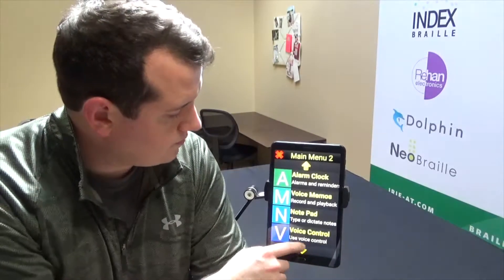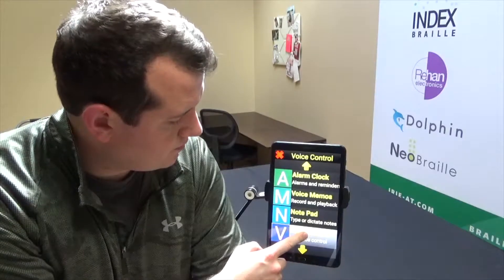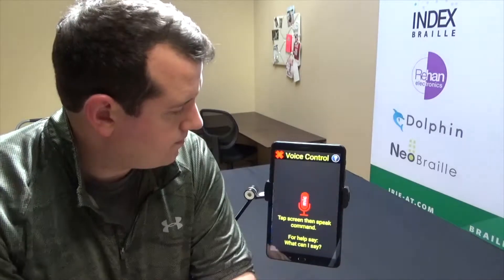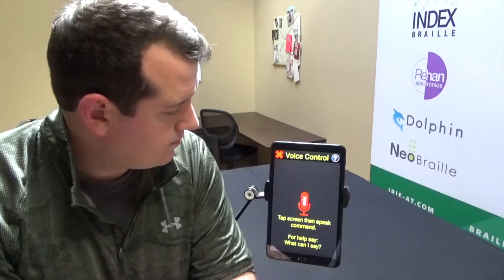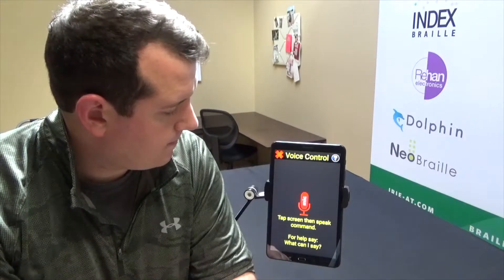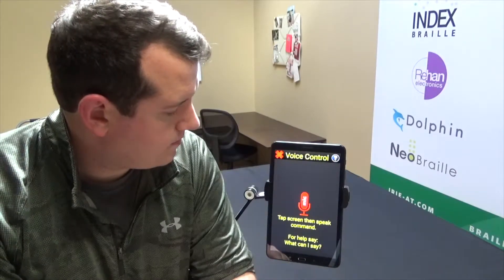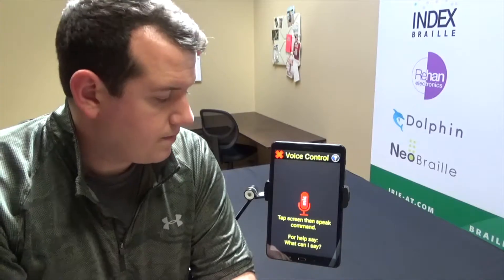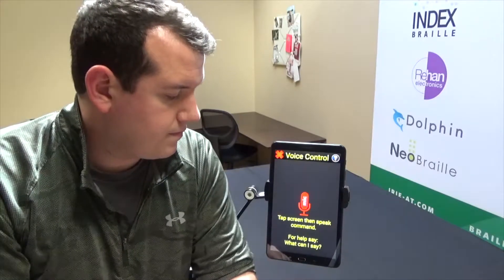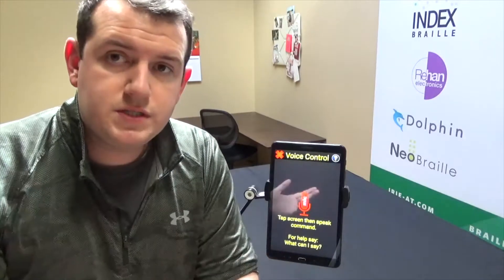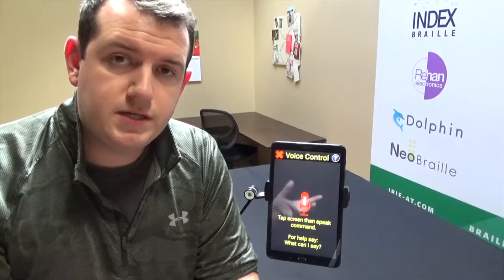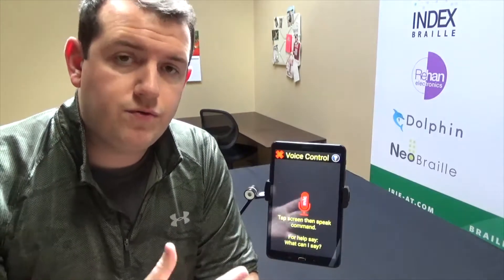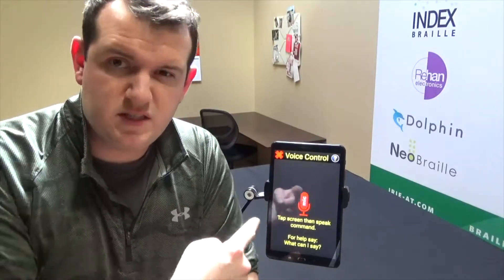I'll go ahead and turn this on and go to my voice control option. From the main menu I navigate to voice control. The device says: 'Voice control — tap screen, then speak command after the beep. For help, say what can I say.' So you tap on the screen, say the command, and then it will do it. I'm going to tap on the screen and say 'send an email to John Taylor.'